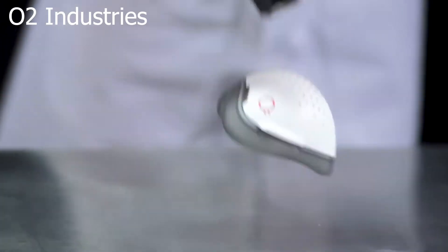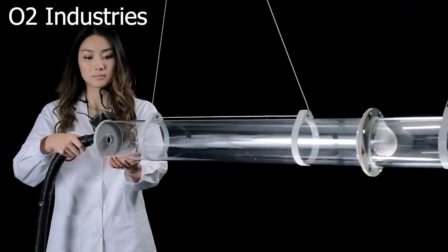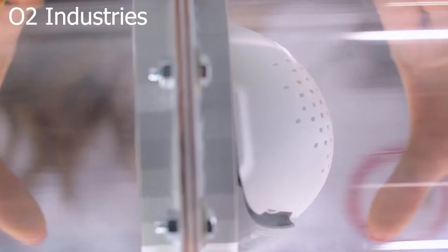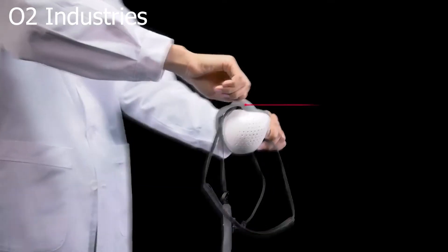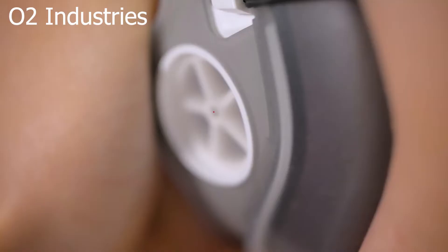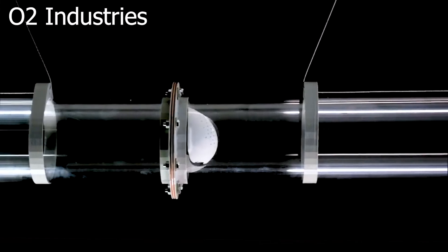Paper and cloth masks don't provide a tight seal between their edges and your face. This means that while they offer some protection against COVID-19 when social distancing isn't an option, some of the droplets that carry the virus can still get into your lungs or out into the world. In contrast, a respirator is designed to fit snugly against your face, keeping more of what you breathe out away from others and more of what others exhale away from you.